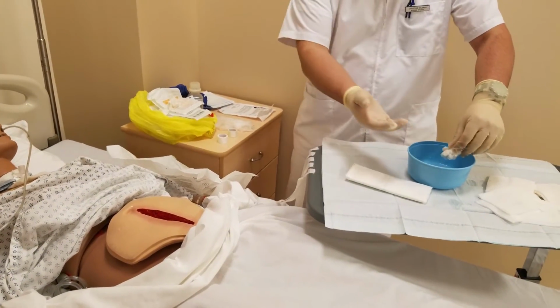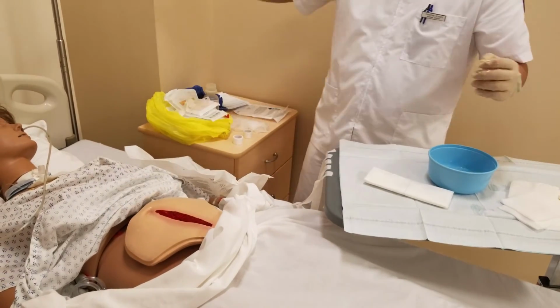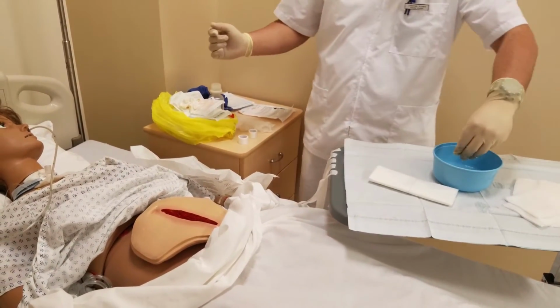Yeah, I held up a bag of normal saline and then I. Now for the other side. Yeah, I'll look at everything.